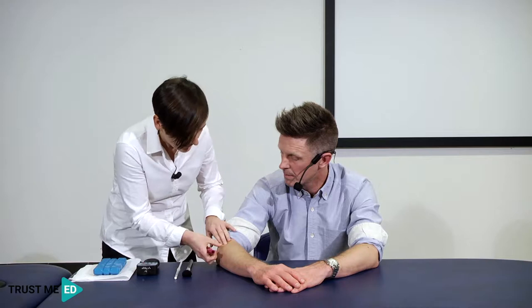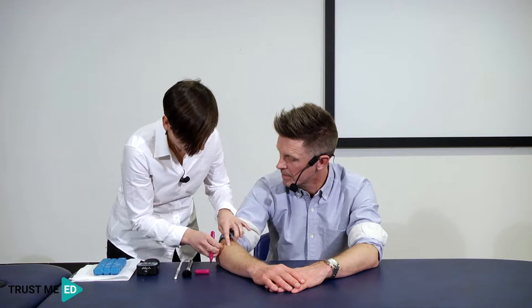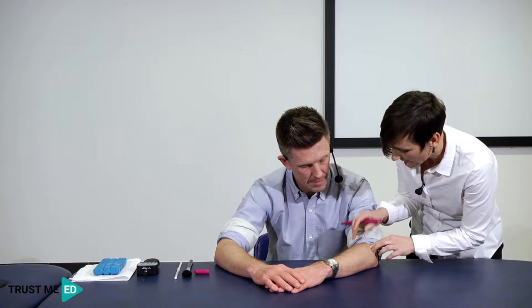I want to make sure I'm testing over the correct spot and find the maximal pain site. Martin, you showed me earlier where you were sore — just tell me where you're most tender. I'm just going to put a little dot on that, and do the same on the opposite side, so I'm comparing over the same area.